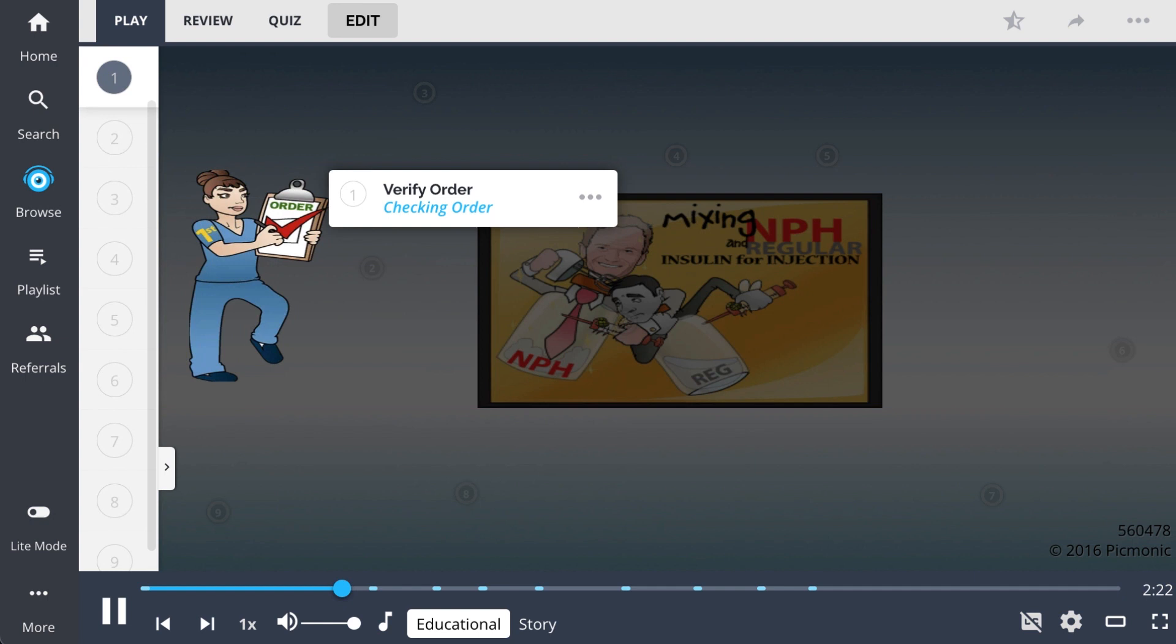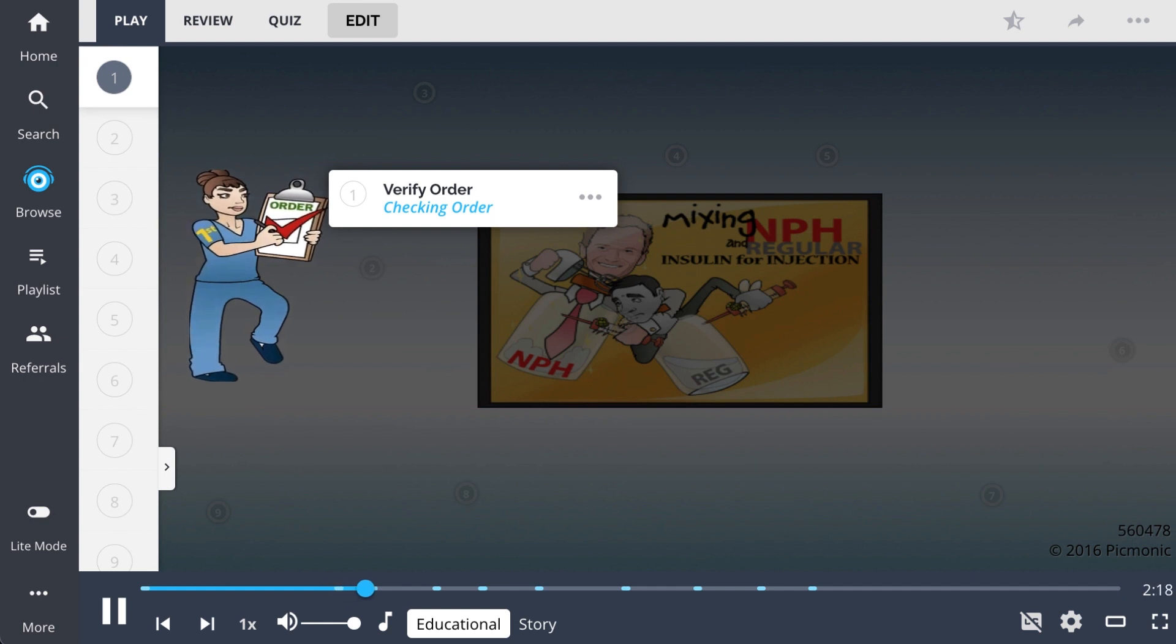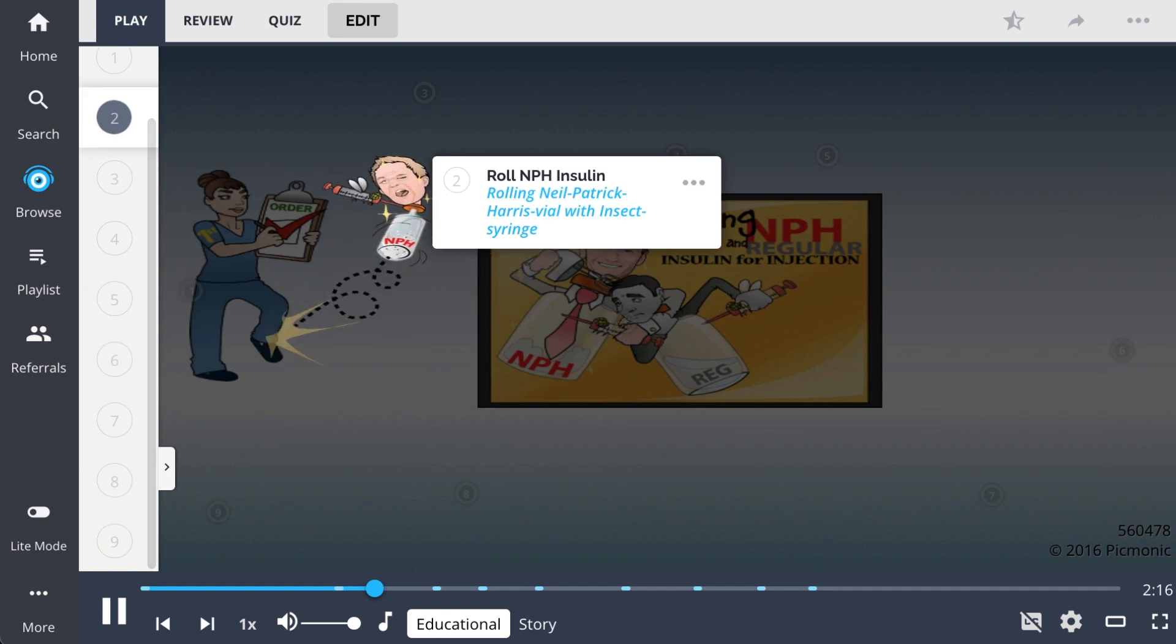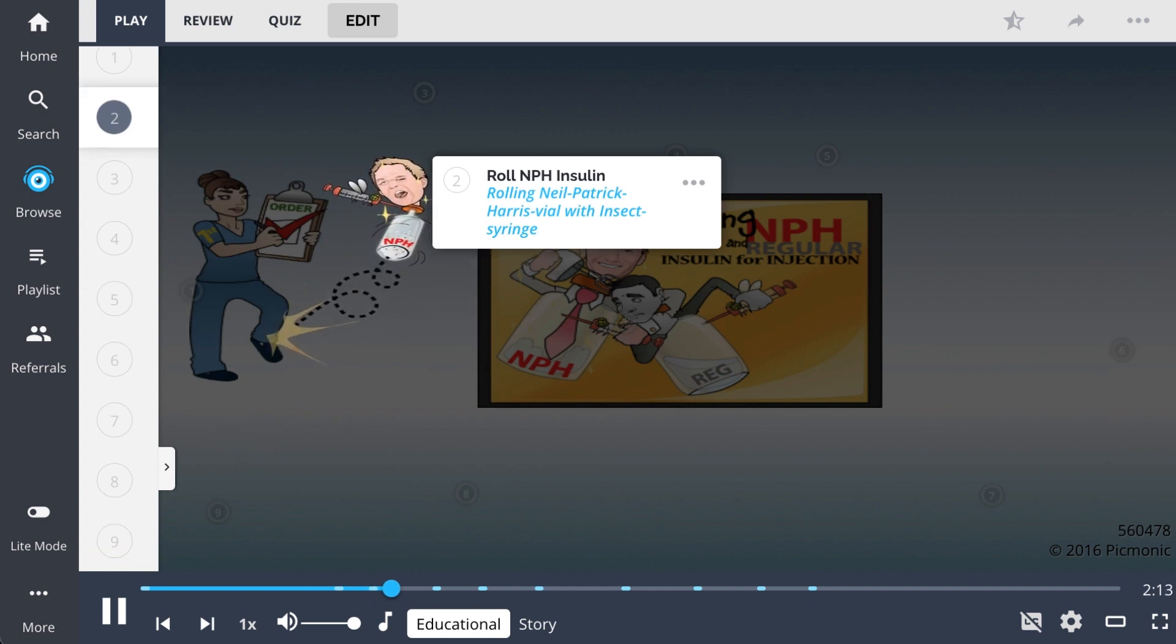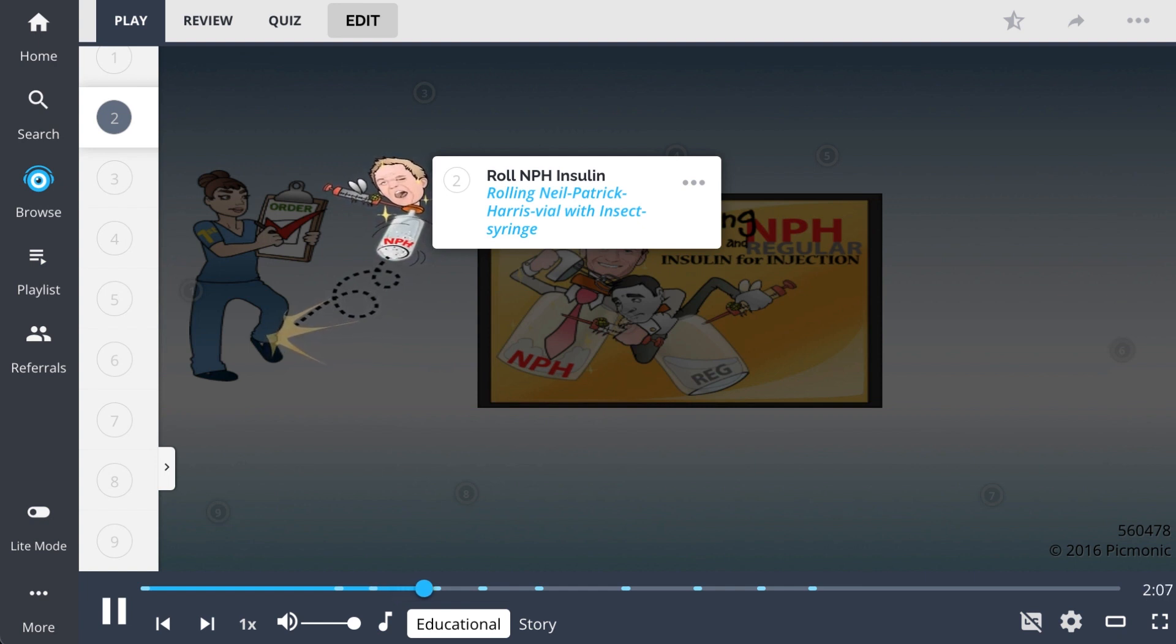First, the nurse should verify the order, checking the order and comparing the labels to the MAR. Next, the nurse should roll the NPH, rolling Neil Patrick Harris, between the hands gently until the sediment has been mixed together. This makes the NPH have a cloudy appearance.